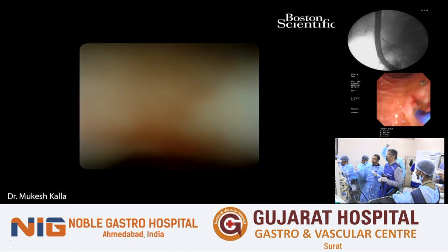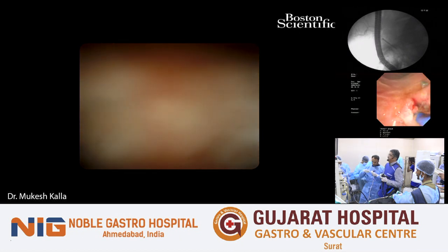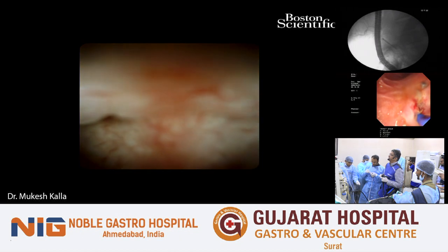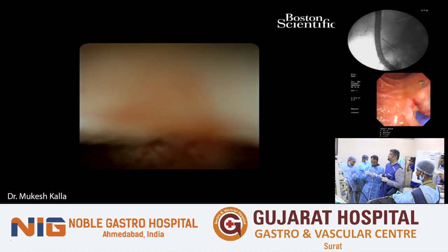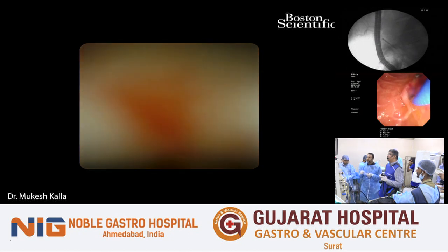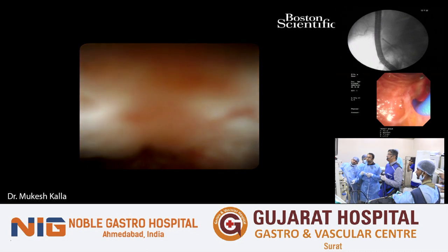So I think I've gone deep inside and there's the end of it, cystic duct. Is it clearly visible in the hall? Yes, sir. Okay. So I have deliberately gone beyond it. I want to facilitate Somil's ease of movement for using the spy basket.